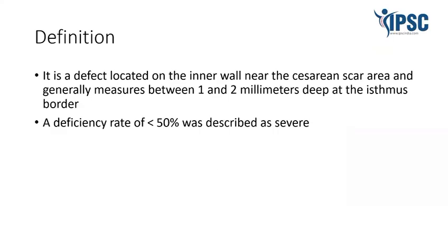4 sutures within it. The 3D ultrasound was attempted, and here you could see that there is a collection within the endometrial cavity extending into the myometrium. So we came to the diagnosis of isthmocele.